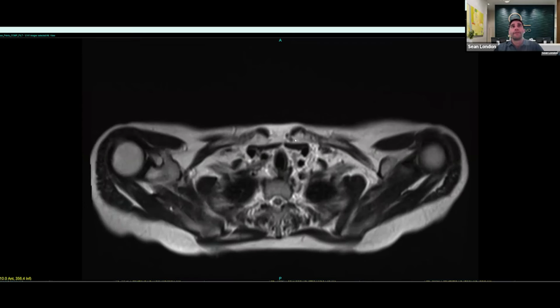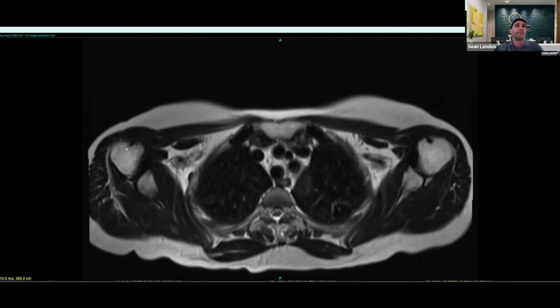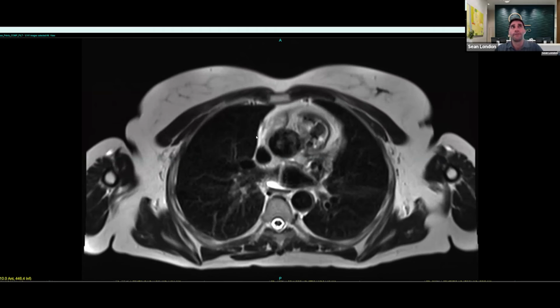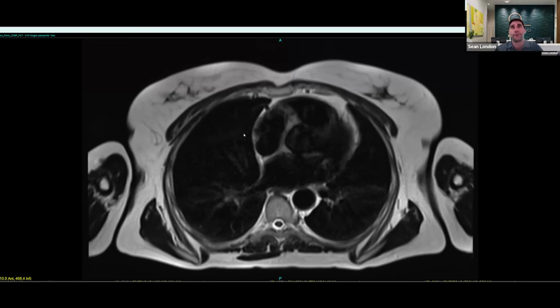So again, as I come down, this is the right side of the image. This is the left side of the image. And as I'm coming down, here we see the right lung right here. It's nice and black. And here we see the left lung nice and black. They're filled with air. These white lines are the vessels that are coursing through the lung tissue. These are normal. What I'm looking for here are any solid nodules or masses or signs of infection, and it generally would show up as a brighter color or signal. And I don't see anything like that in either lung, so both of these look clear.